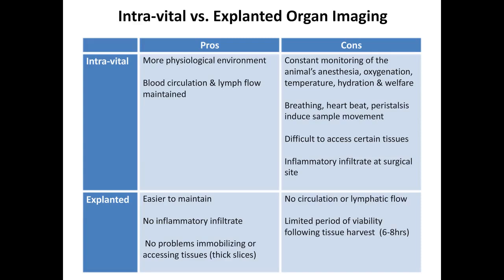The animal, typically in our work we use mice for study of the immune system. You will have to have a constant monitoring of the mouse's anesthesia, the oxygenation, as well as the body temperature, hydration, and overall welfare.